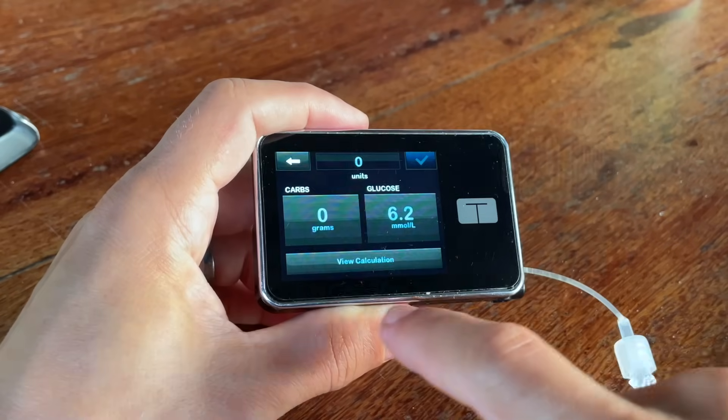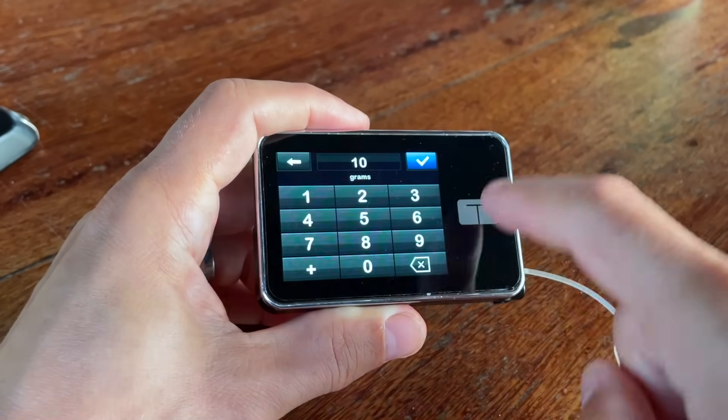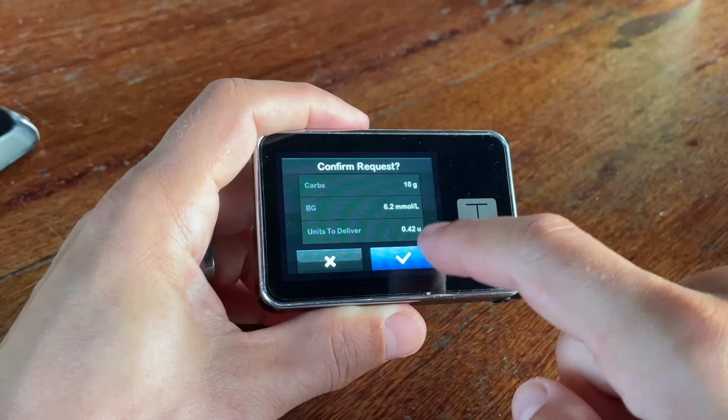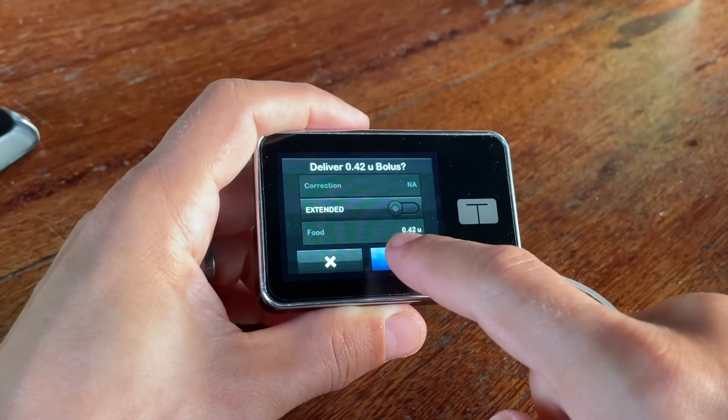The pump has a built-in carb-to-insulin calculator. Once you've set up your carb-to-insulin ratio, you can just tell the pump how many carbs you're planning to eat and it will calculate the amount of insulin you should bolus.